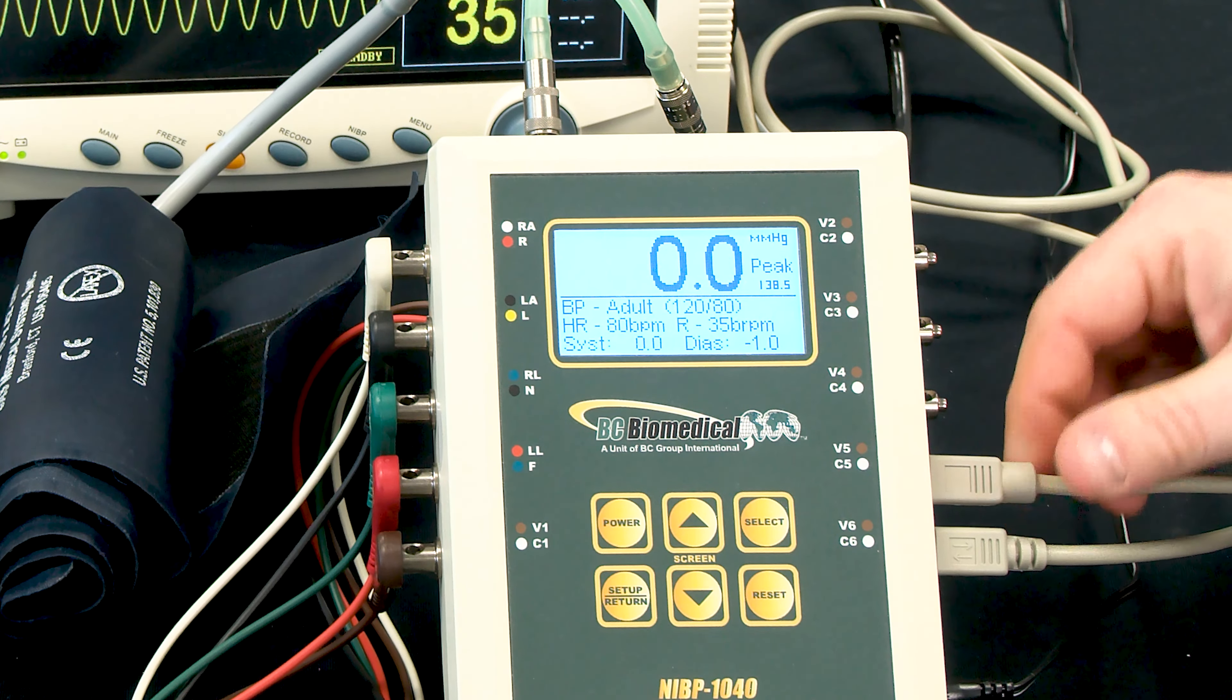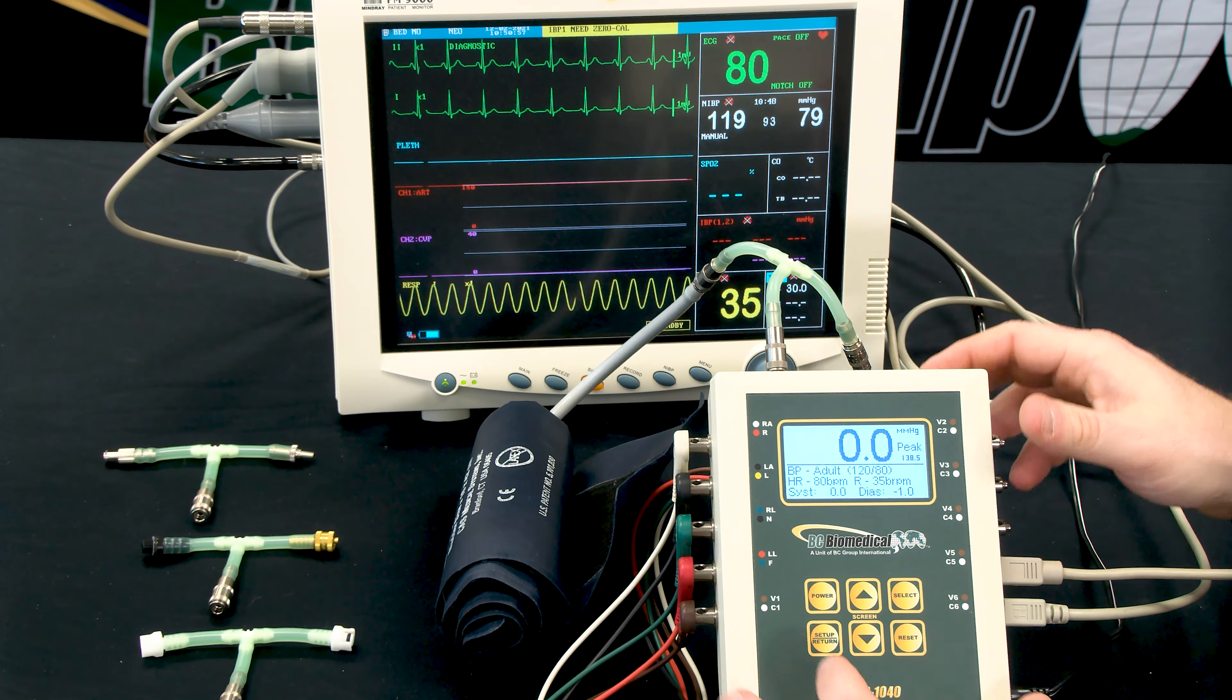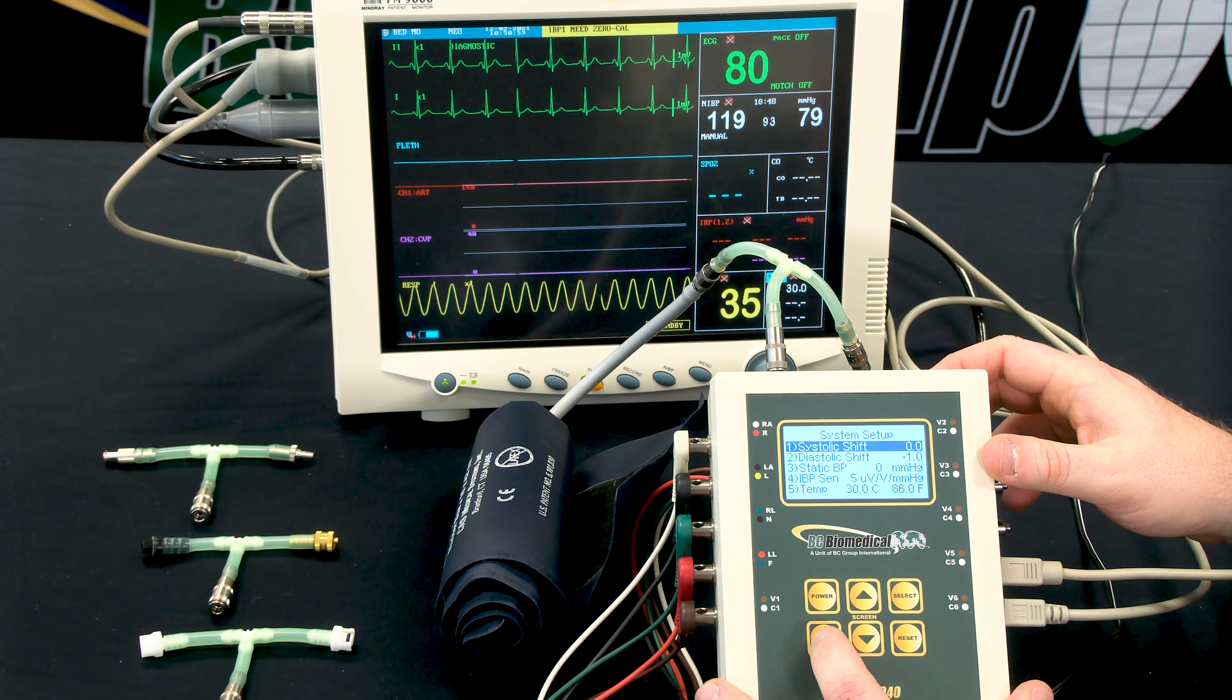Most monitors, the first time you plug in the cable, if you change the cable, or if you power cycle the monitor, they have to be zeroed before they'll measure invasive blood pressure.